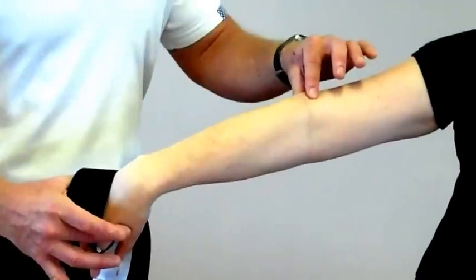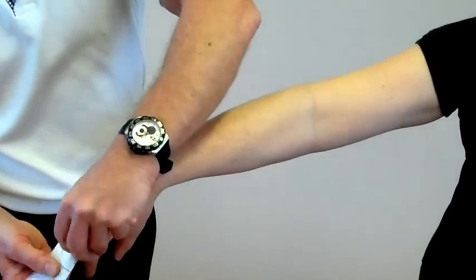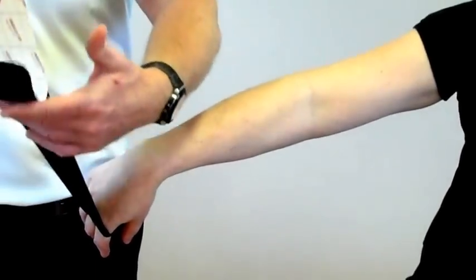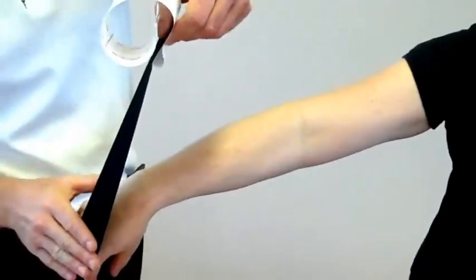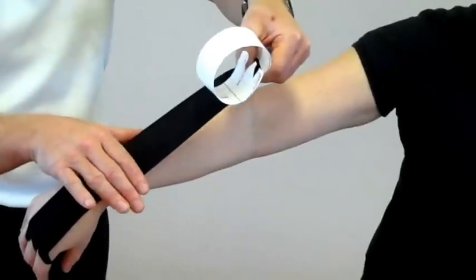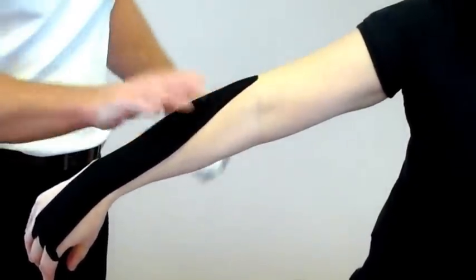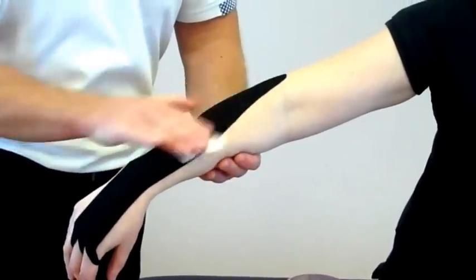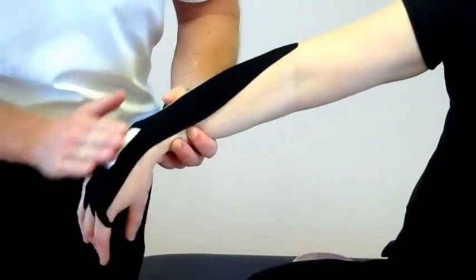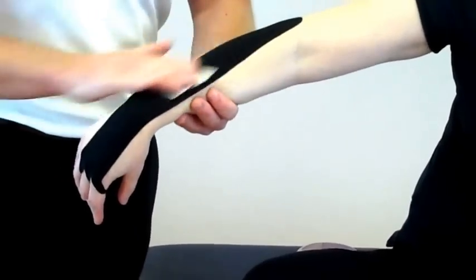Now we've got tissue stretch on the extensor carpi. Peel back this tape so we're left with one square at the end. Little to no stretch on the tape — what we're going to do is literally feed that and cross the top of the forearm, and hopefully it'll just cross into the lateral epicondyle, like so, which is perfect. Rub the back of the tape to warm it up and pre-activate the adhesion.